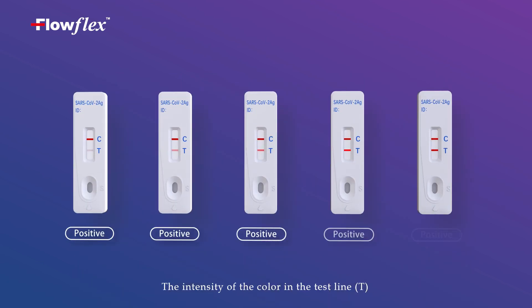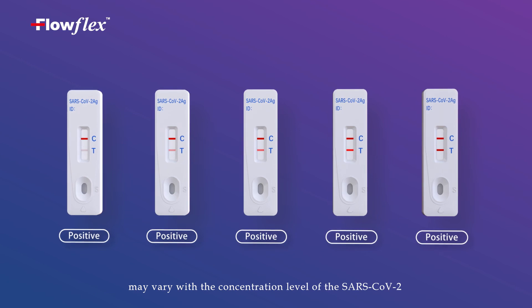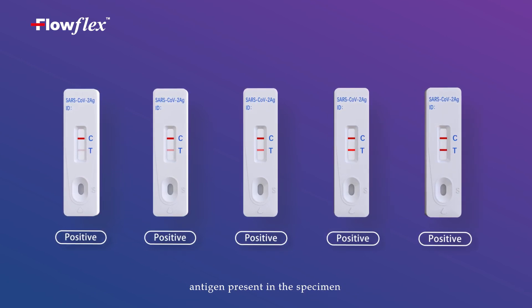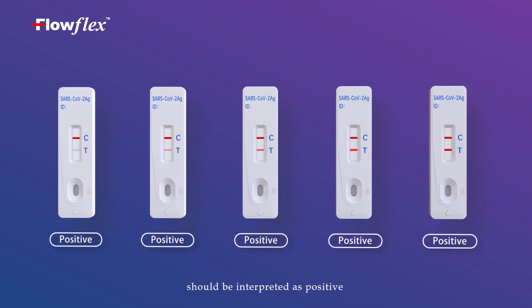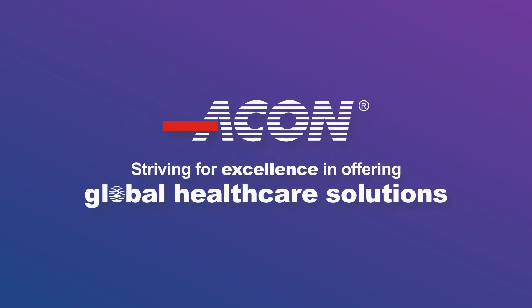The intensity of the color in the test line T may vary with the concentration level of the SARS-CoV-2 antigen present in the specimen. Any shade of color in the test line region T should be interpreted as positive.